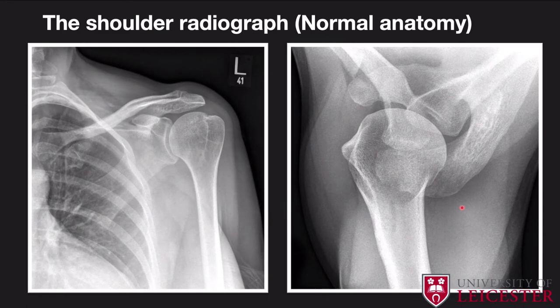Now let's cover the shoulder radiograph. Starting with the collarbone — the clavicle — you have a medial and lateral end. It articulates with the acromion, and this joint is commonly called the acromioclavicular joint. The next key structure is your scapula, which has quite a lot of protrusions and components to it.